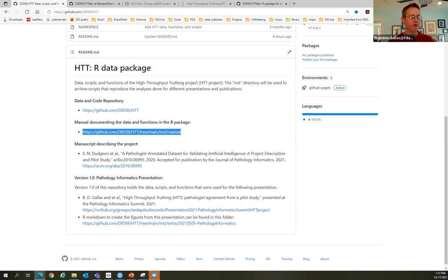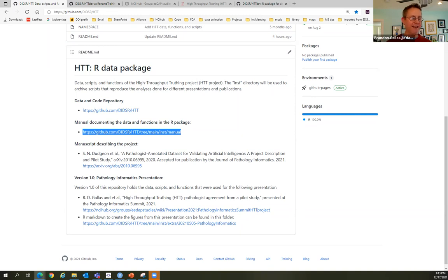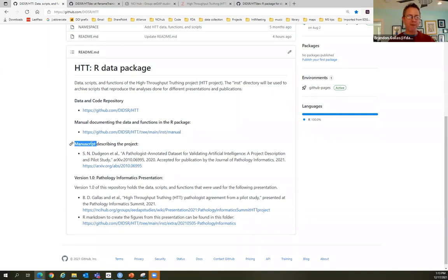Please interrupt me at any time. There's going to be a lot of R and a little bit of Git. We have a manuscript describing the project and the data. There's a peer-reviewed publication out now — I just haven't updated this README. Version 1.0 of this public repository was shared over the summer to share data, scripts, and functions used for my Pathology Informatics and JSM presentations. The R markdown file shows exactly the steps done to create the figures.